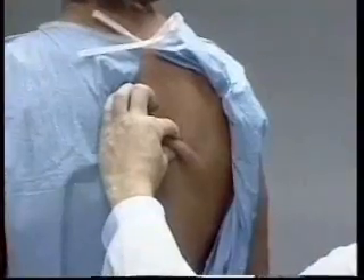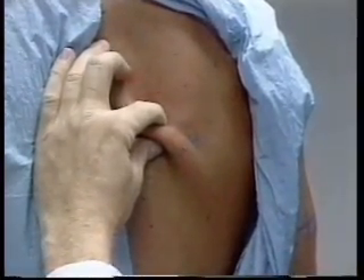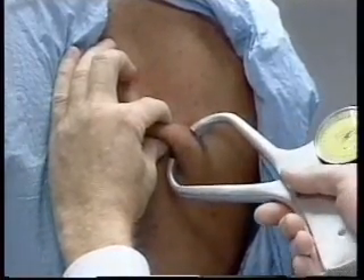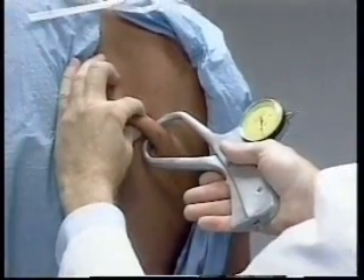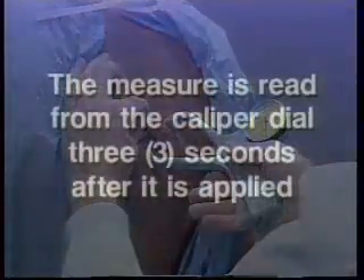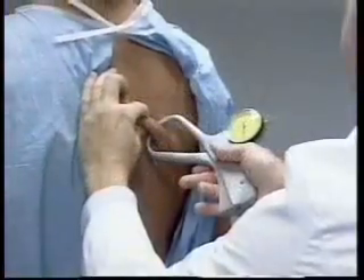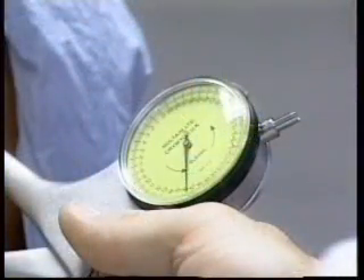The thumb and index fingers separate the subcutaneous fat from the underlying muscle. Just enough skin and adipose tissue is taken up to form a distinct fold. The jaws of the calipers are placed perpendicular to the length of the fold while the technician continues to hold the skin fold. The actual measurement is read from the caliper dial three seconds after the caliper tips are applied to the skin and the tension is released from the caliper handle. The skin fold thickness is measured in millimeters to the nearest tenth of a millimeter.